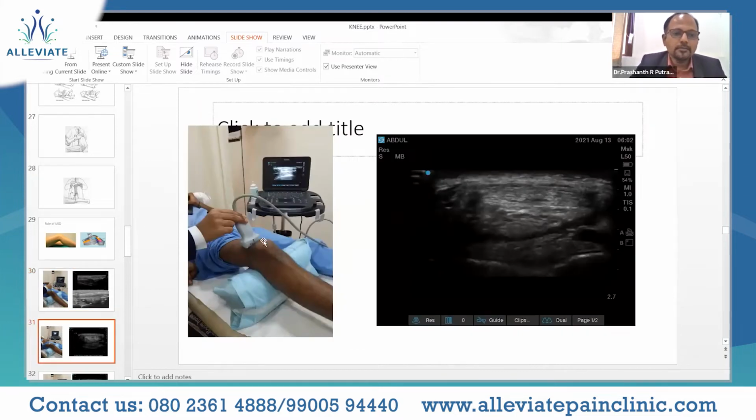So the same suprapatellar area in a transverse section. Here again we see the hyperechoic femoral bone shadow, then the pad of fat, and then the quadriceps. The quadriceps is made up of four important muscles: the vastus intermedius, vastus medialis, vastus lateralis, and the rectus femoris.